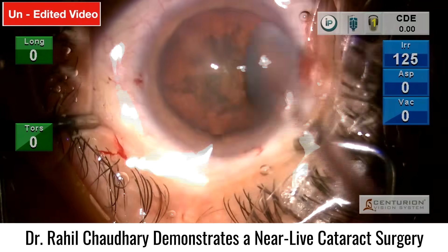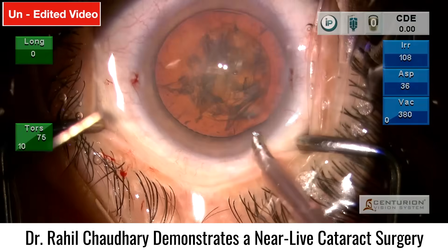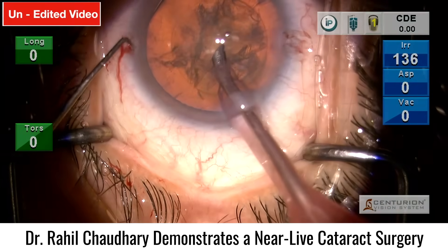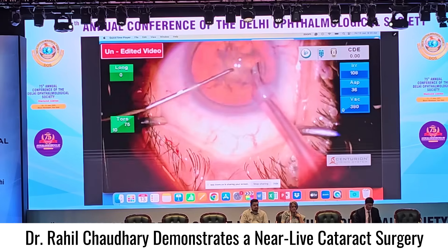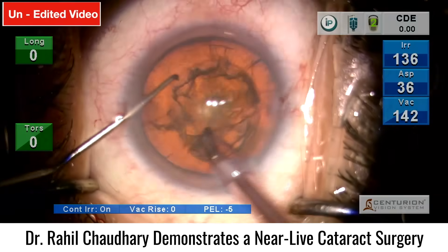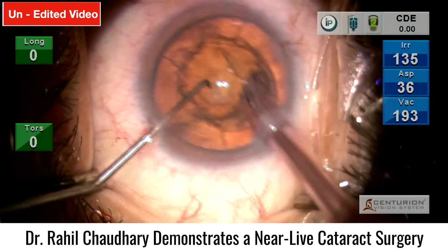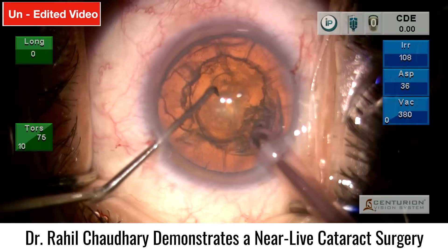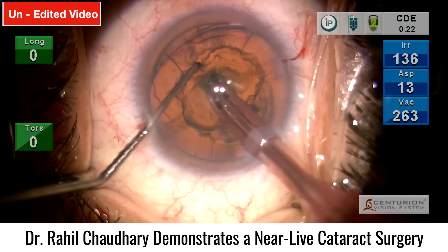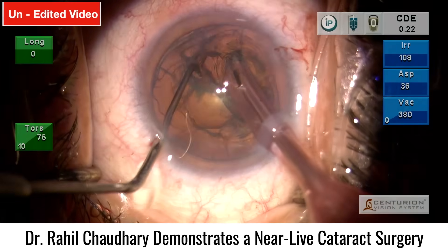I use longitudinal mode for the chops, then switch to the torsional component for emulsification. I am using the Kelman tip here because the grade of cataract is low — it's a soft cataract, so easily managed with the Kelman tip. For harder cataracts I usually shift to the balanced tip. Now burying into the nucleus to take the first direct chop.